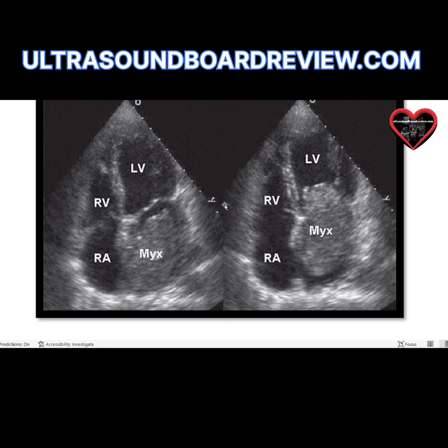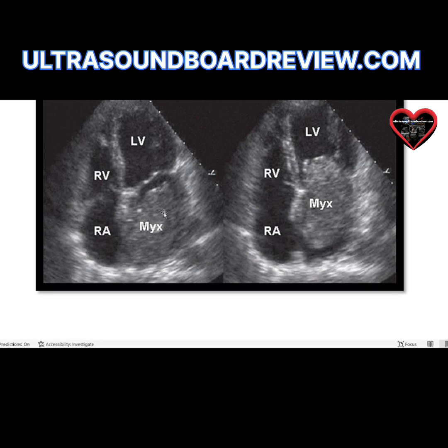Here's a good example of a myxoma. Here's systole and here's diastole. You can see that in diastole, this tumor is protruding or invading the left ventricle. If you just have a still image and it says what structure is in the left atrium, you can see that this tumor is attached to the fossa ovalis — it's pretty easy to identify. You can see how globular and homogeneous it is, as well as really smooth, with that smooth texture.